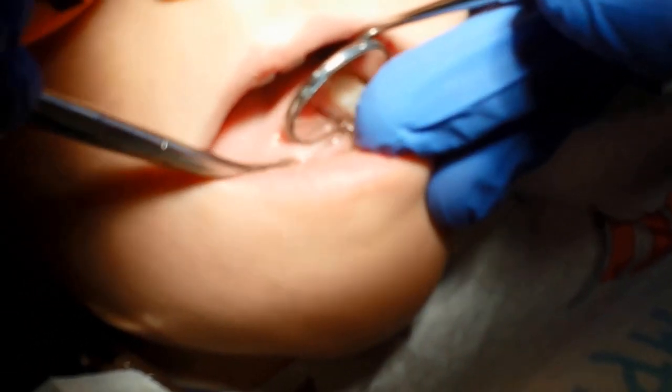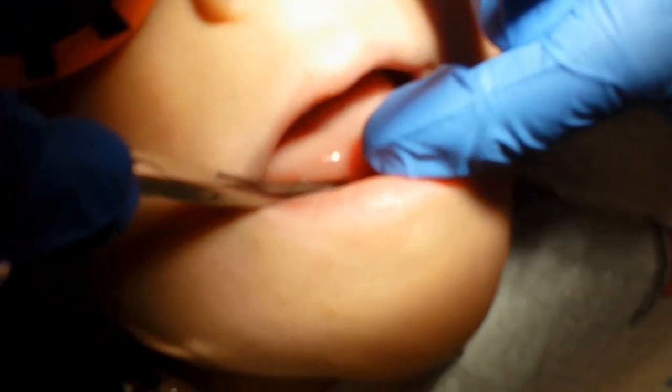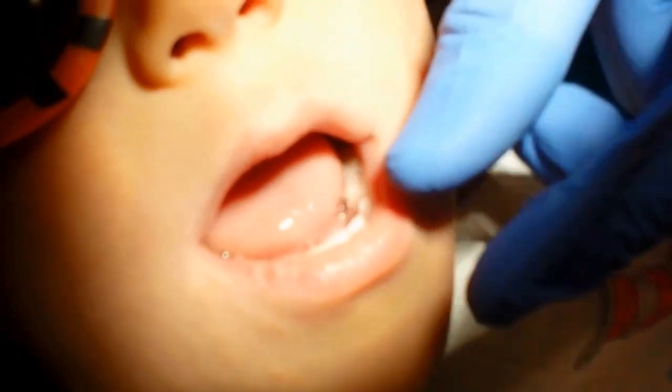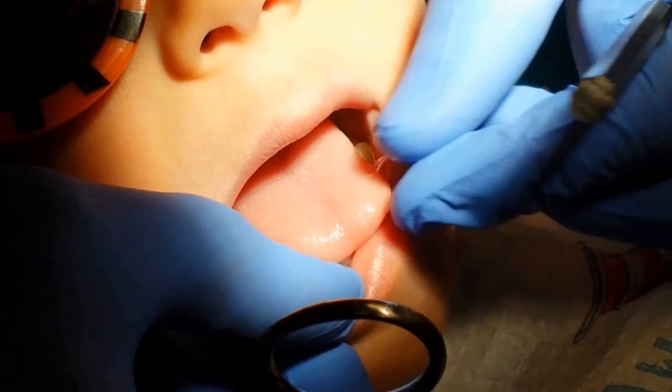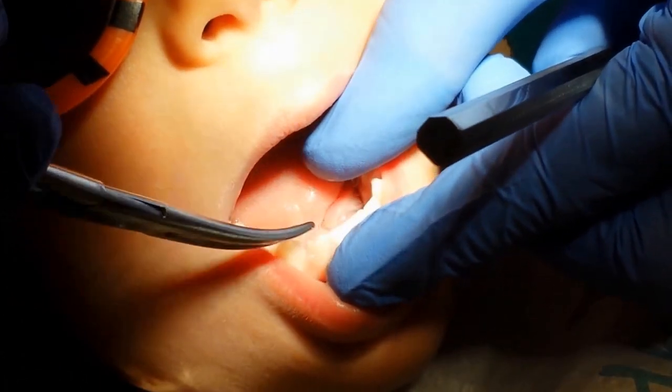We're removing the frenulum from underneath this patient's tongue. Our concern is that it affects his phonetics and his speech. Stick your tongue out at us — that's about as far out as he can go, and you can see how it starts splitting his tongue right there, pulling on that skin.